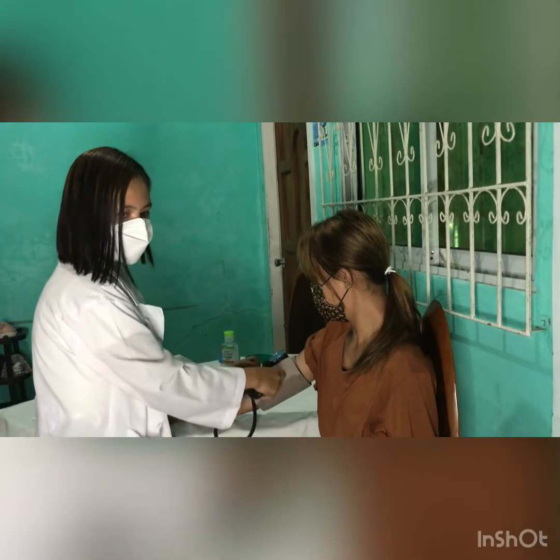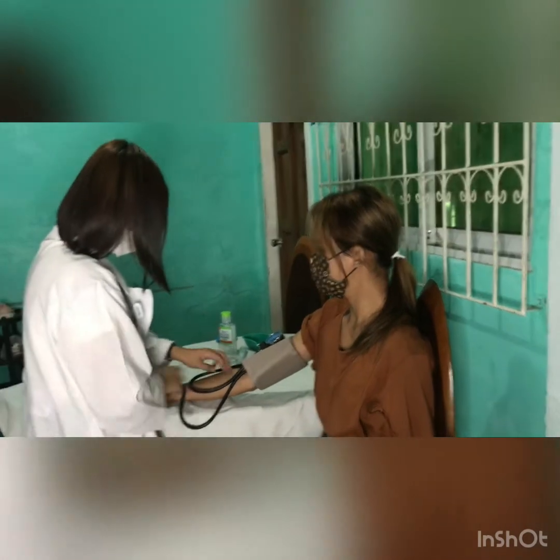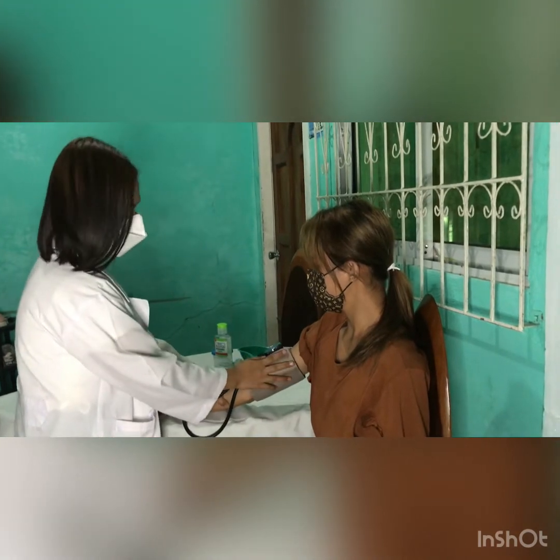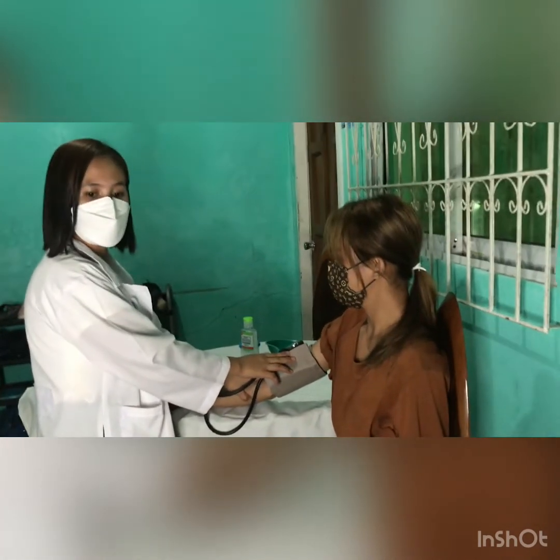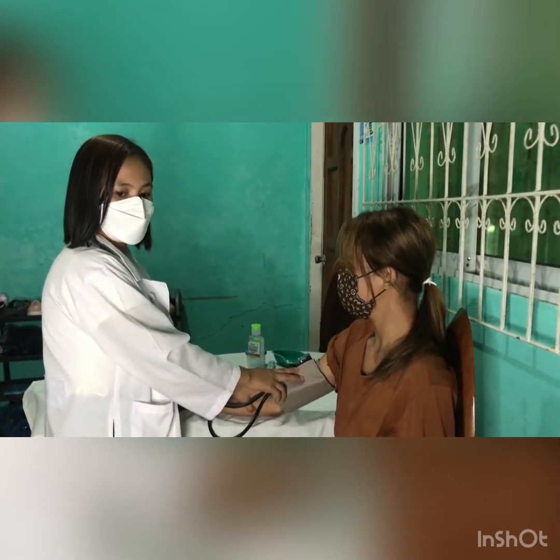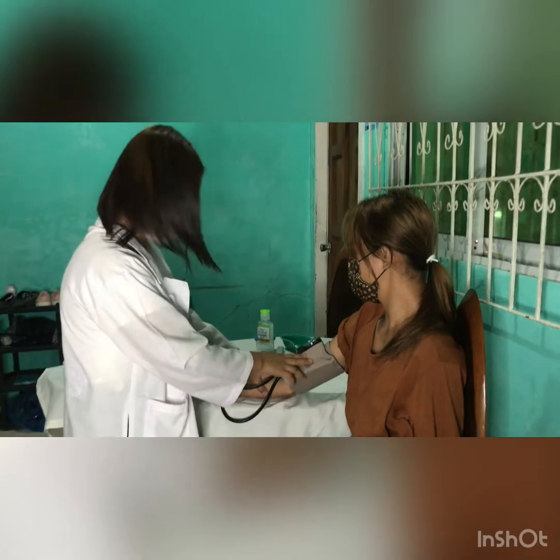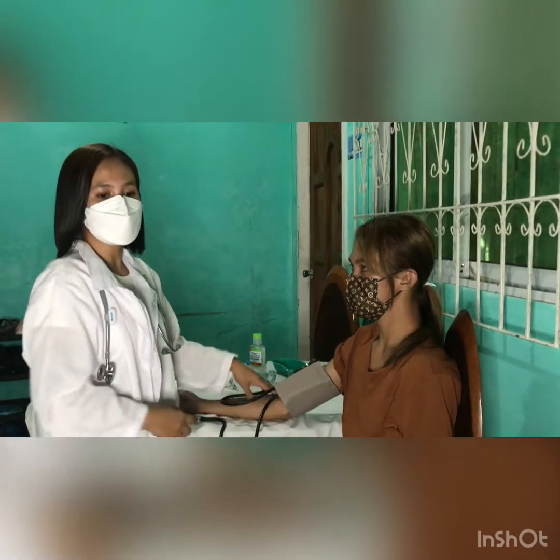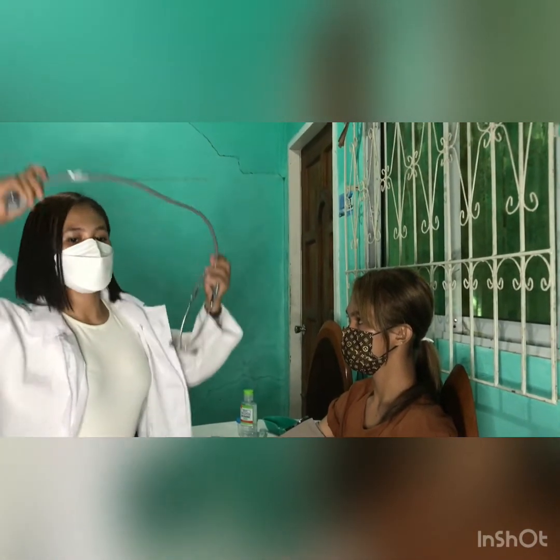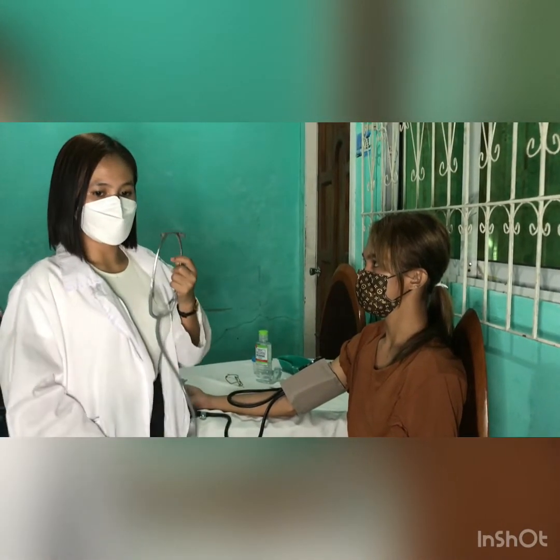Then, make sure the cuff is not too tight by inserting two fingers into the BP cuff. Then, position yourself so that the manometer is vertically at eye level. Observation should not be farther than 1 m, approximately 1 yard away. Then, insert the earpieces of the stethoscope in your ears so that they tilt slightly forward, and be sure sounds are clear and not muffled. Then, ensure that the stethoscope hangs freely and is not in contact with any object.